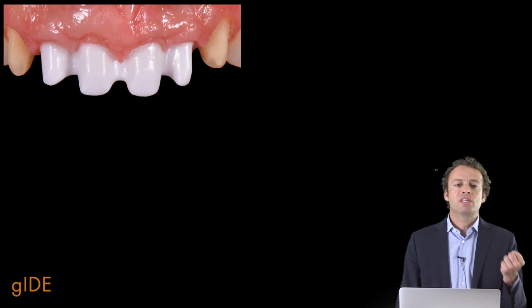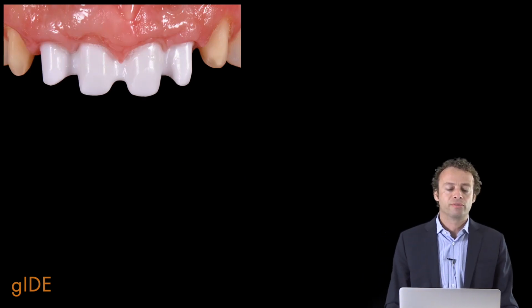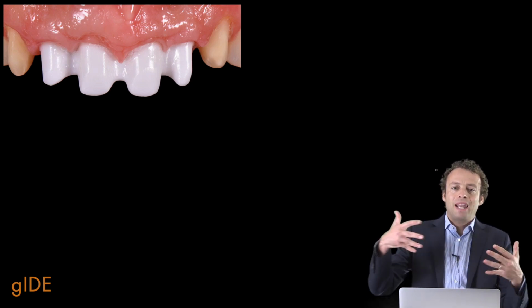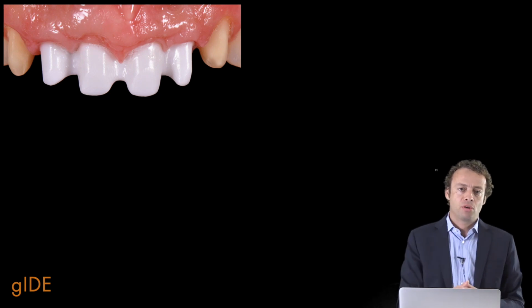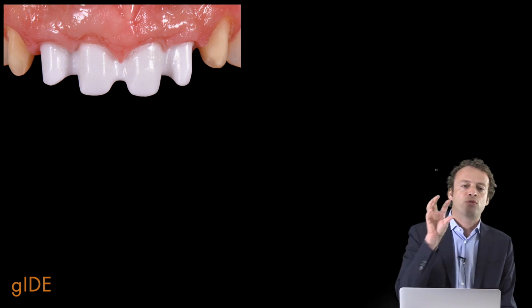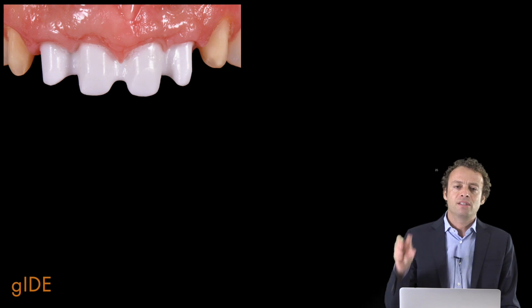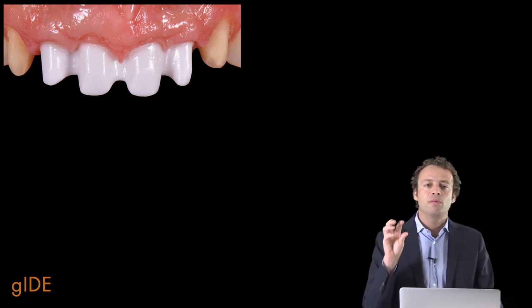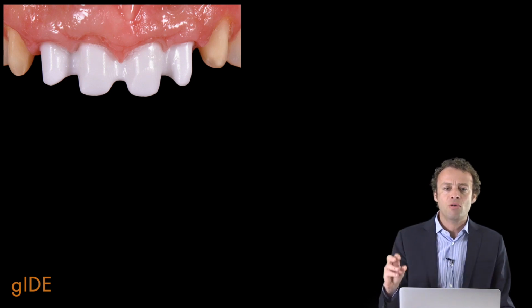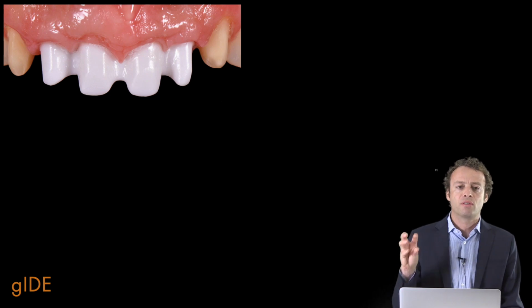And in that way, when we receive the zirconia framework from the lab, this is exactly what we observed: a perfect seating of the framework onto the implants and a perfect blending of the framework with the soft tissues, with really minimal ischemia. So this framework doesn't require any important adjustment. And it is really critical and important, in particular speaking about the zirconia framework, which is a material so reliable, so safe, so stable, but it's important to use it in the right way.